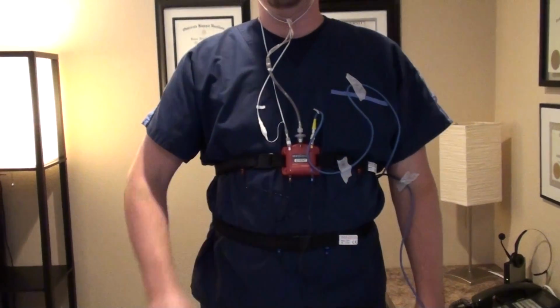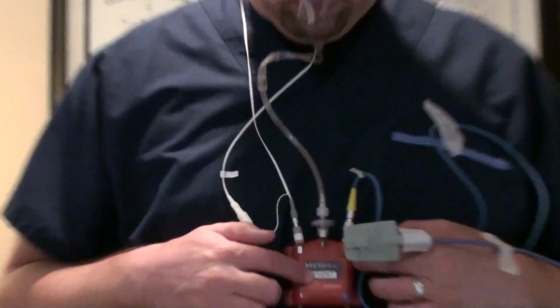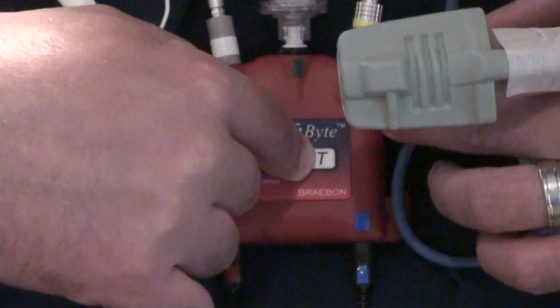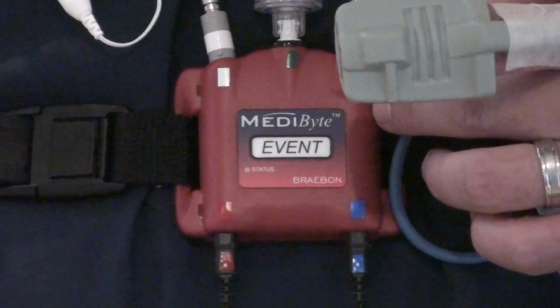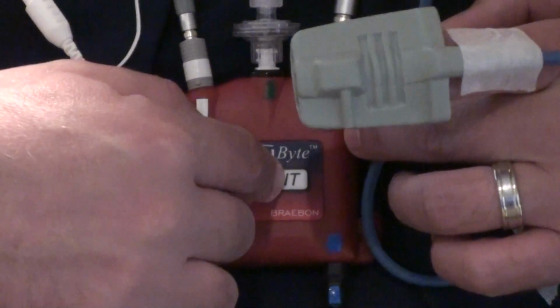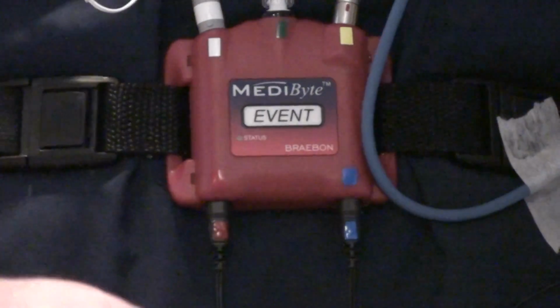Once you are wearing all of the sensors and the leads are connected to the MediByte, the unit is ready to collect data. The unit is programmed to start automatically at the designated time we have set up. The event button is used to mark significant events during the night. For example, press the event button when turning off the lights, when getting up during the night, or upon returning to bed, etc. In the morning, push the event button and remove the tape and sensors.